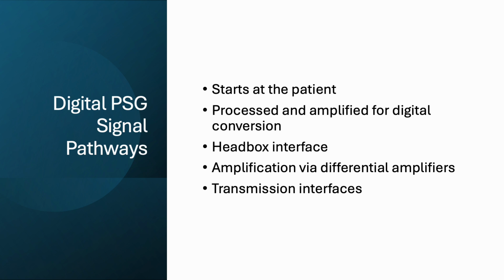All this information has to be transmitted from one location to another, usually with routers and cables. Each one of these separate components from the patient to the PSG computer screen has the potential to make the signal noisy or dirty.